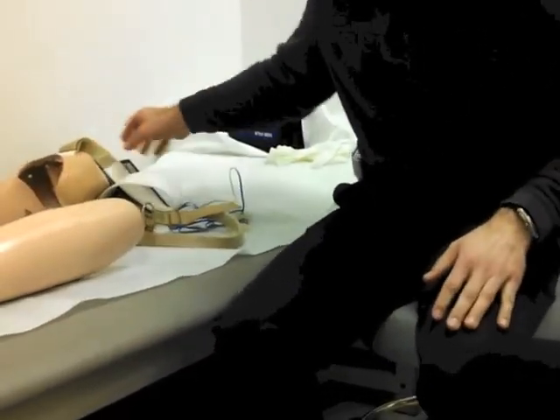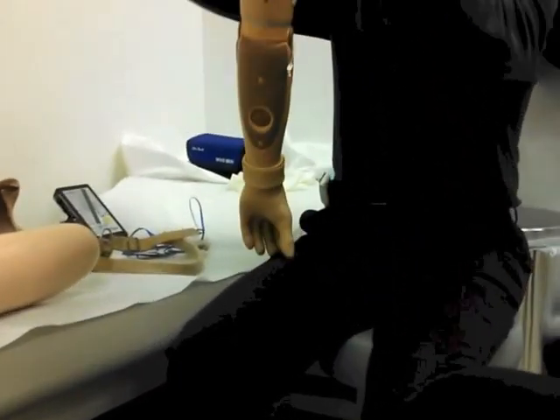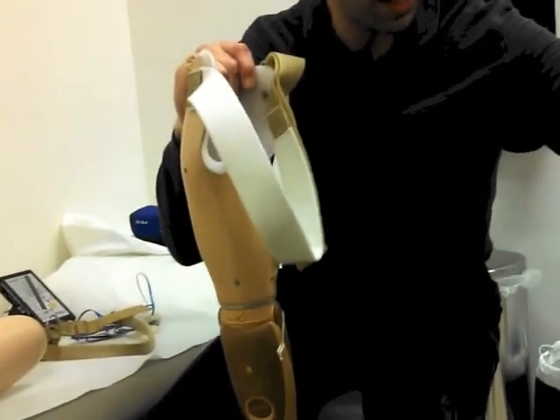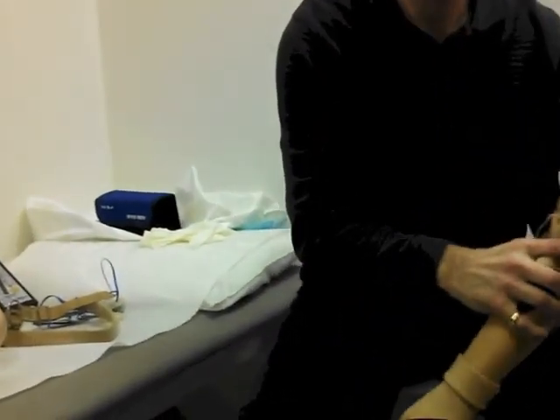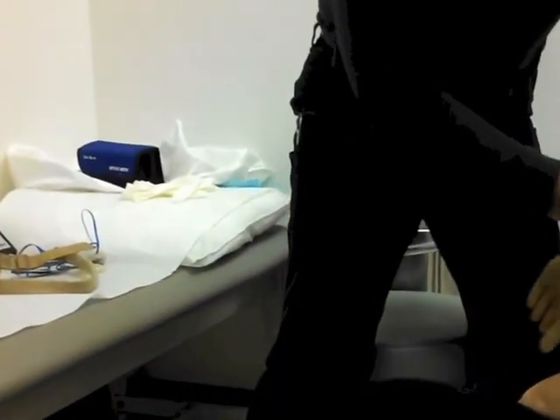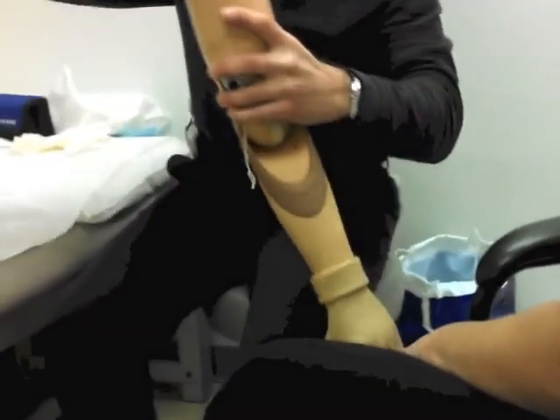For above the elbow, like yourself, most people have what we call a chest harness. What we do is we come around the chest — it would come underneath the armpit on this side, come right across. This is the socket design; this is for the left side, but basically it would come right up into this area just like this, and then the chest harness would come right across.